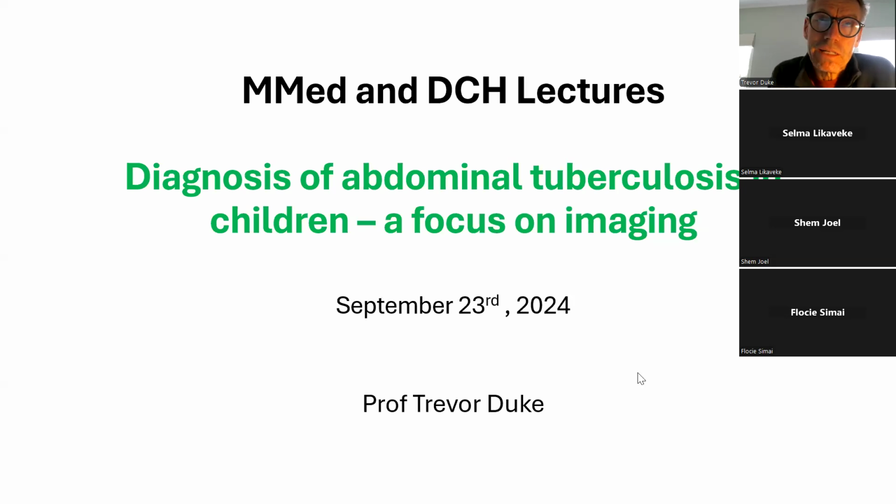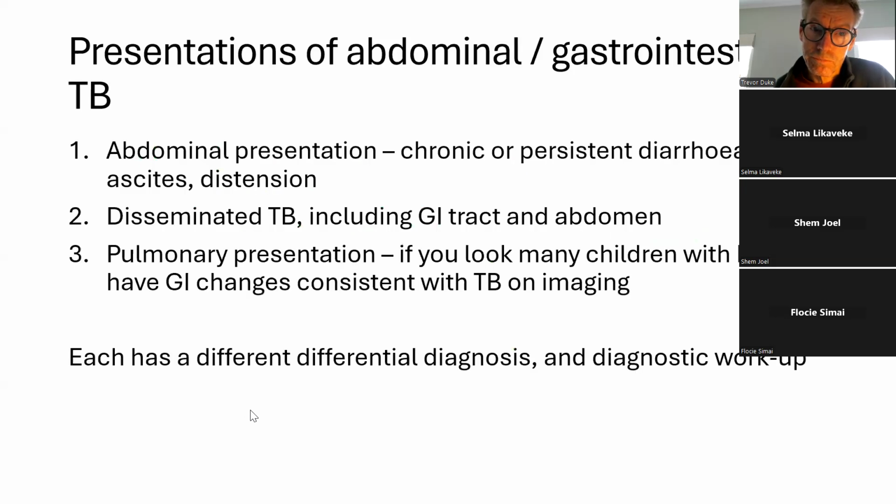In the process of that, we haven't previously in the lectures talked much about ultrasound, but I'm going to try to explain some concepts of ultrasound, not too much, as they apply particularly to the diagnosis of abdominal pathology and especially to the diagnosis of abdominal tuberculosis.